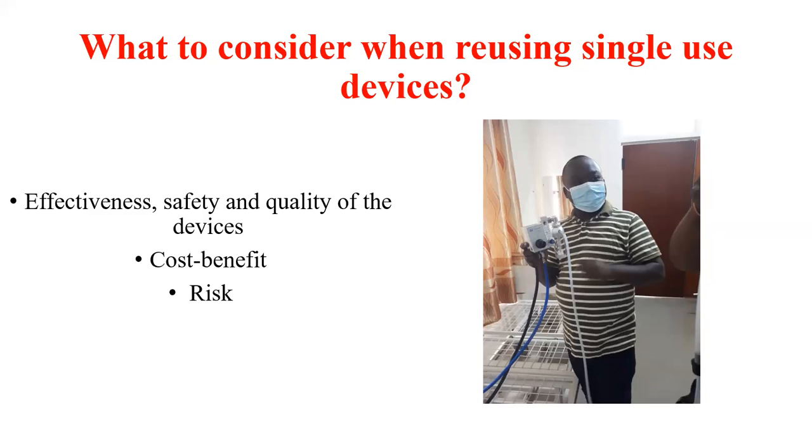And to me, the device I'm holding in my hands is the high flow nasal cannula, which may deliver 60% FiO2 to 100% at low oxygen flow. So if you are able to have such a machine or such a device around you, please use it. It's effective and less costly because it doesn't consume too much oxygen, and it is good for the patients on whom I used it. They appreciated the device.